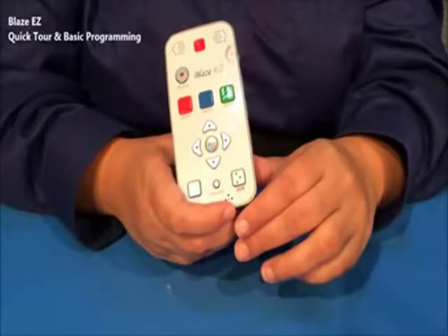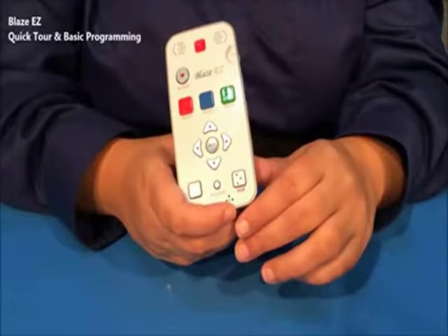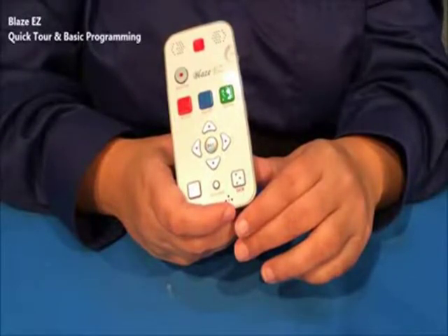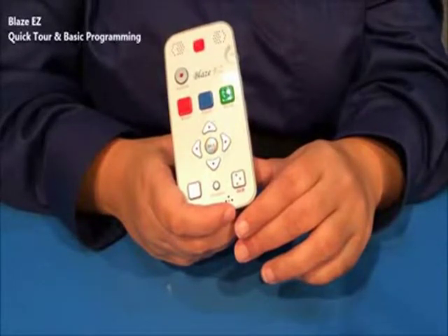The Explorer actually gives you files related to the specific program you're in. For example, if you open the media player and you press the Explorer button, you're going to get all of the media content available on the internal flash disk, as well as any SD card or USB drive connected to the Blaze EZ. So it will automatically scan for content when you insert a disk or on boot up, and when you press the Explorer button, it gives you all of the media-related content.